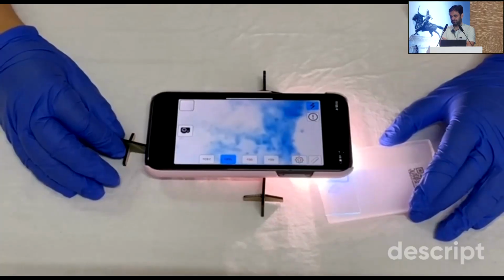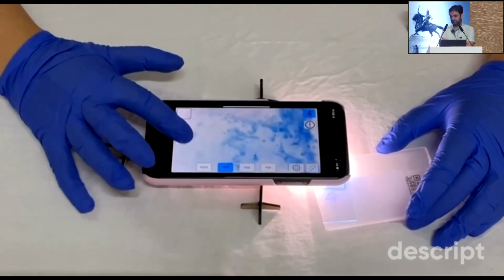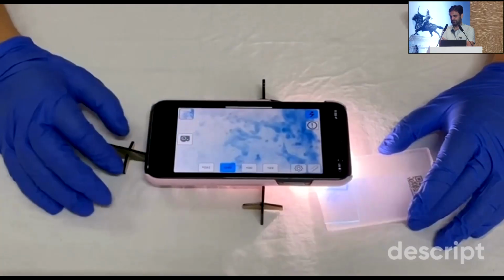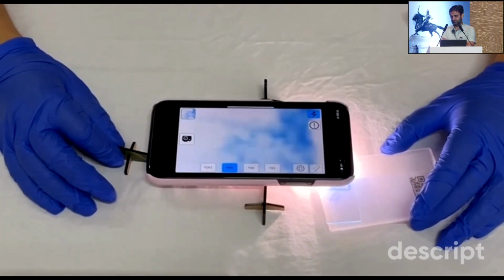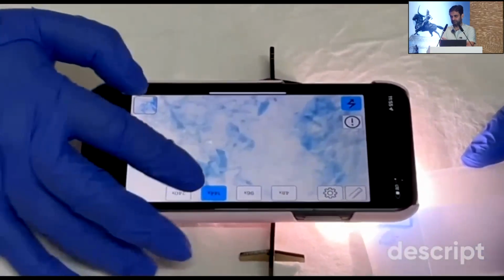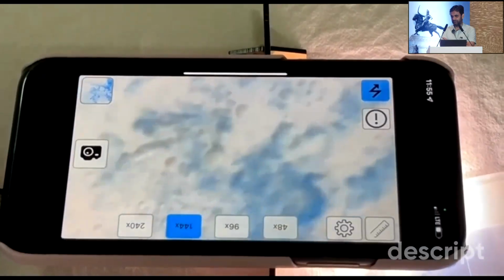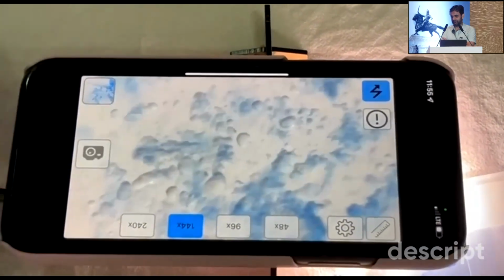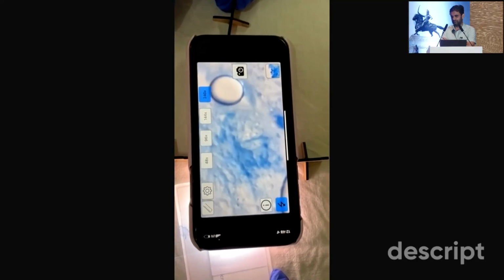The image quality is quite remarkable for a point-of-care device. We can capture still images directly which are saved to the phone's gallery for documentation or sharing. The ability to scan the entire smear quickly and document multiple fields is a significant advantage for a comprehensive evaluation, ensuring we don't miss isolated filaments. And as you can see, the stained fungal filaments become clearly visible.